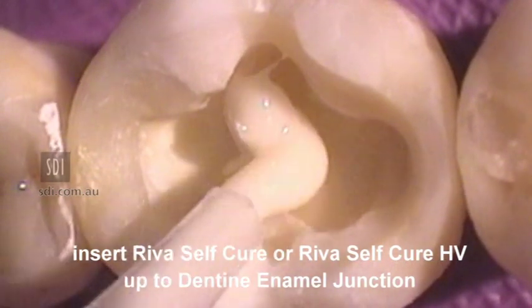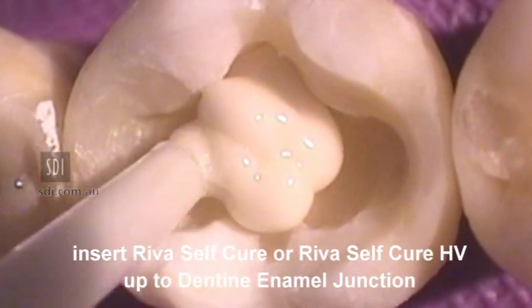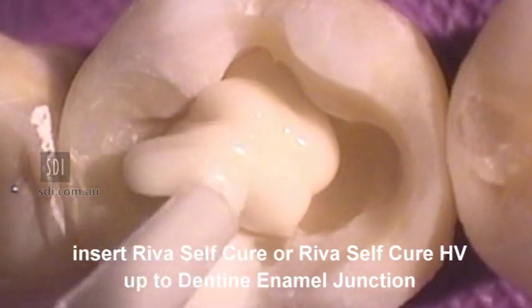Insert Riva SC or Riva SC HV into the preparation up to the level of the dentino-enamel junction.